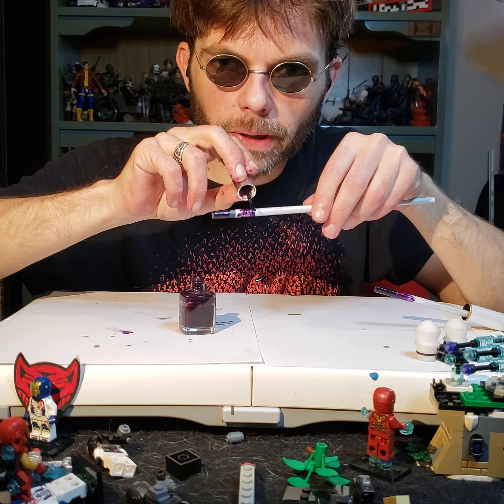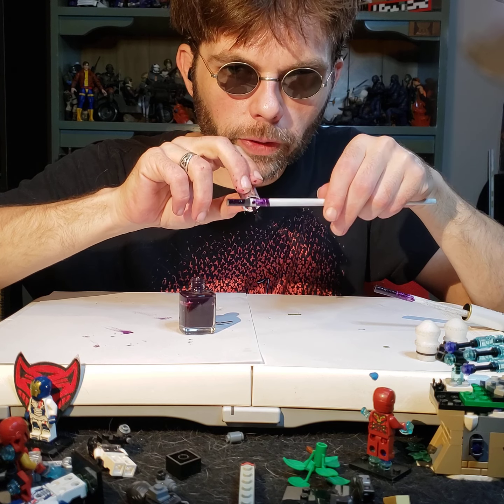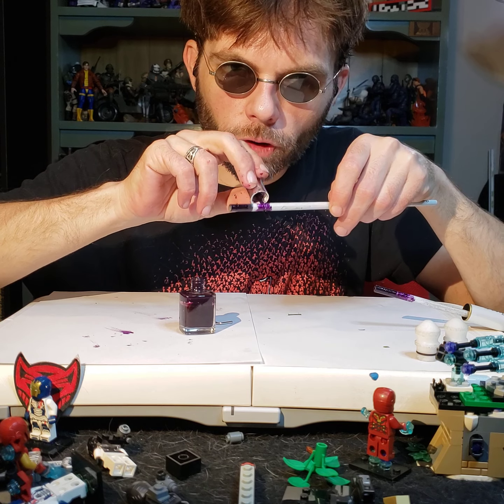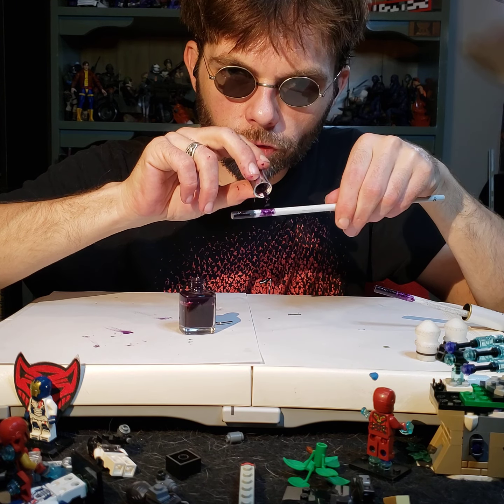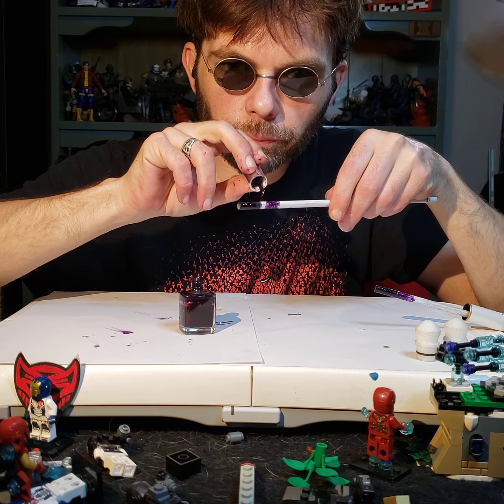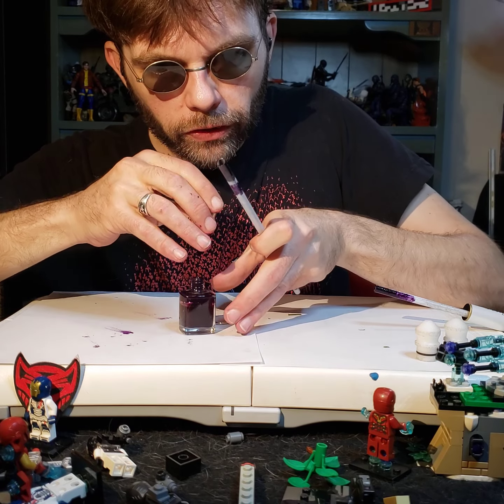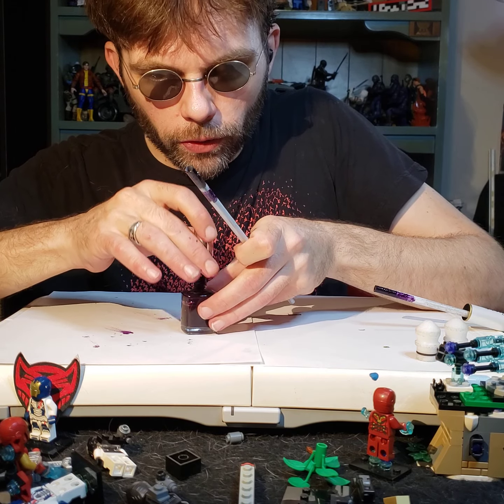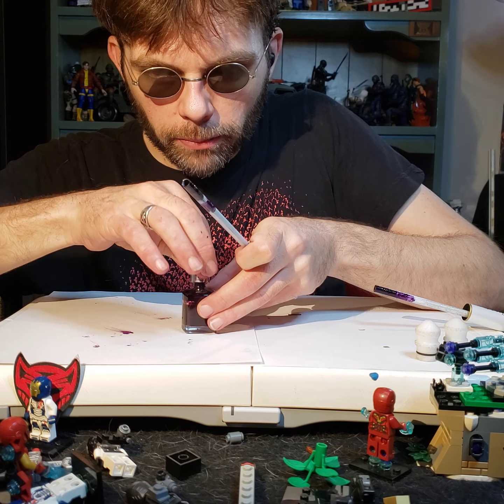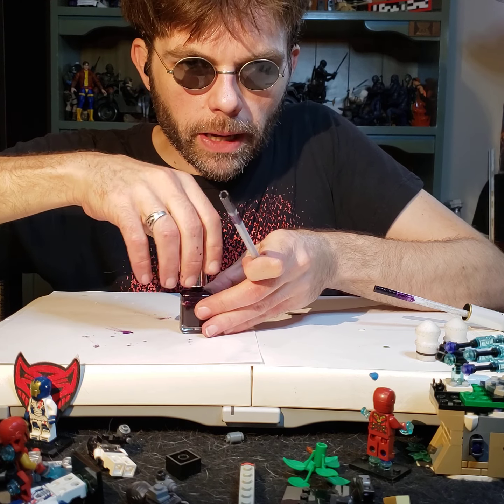There we go. And remember, when you do this, you don't want to go up and down the shaft. You don't want to go vertical with this. You want to go horizontal, because if you can get the brush strokes in there, each one of those brush strokes will act as a little gripper to help grip your cane whenever you pull it out of its little chute. So it's important to have those. Don't go vertical. All you do is make it more difficult for your cane to actually hold its stable position. Get in there, you stupid brushes. Okay, there we go. I think that's good.